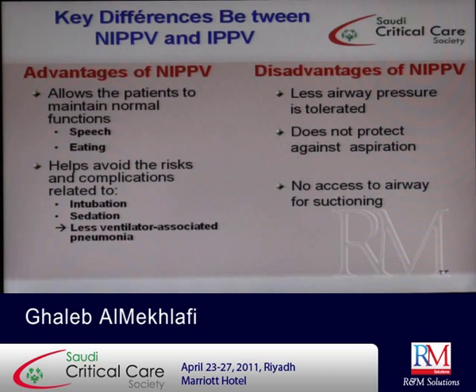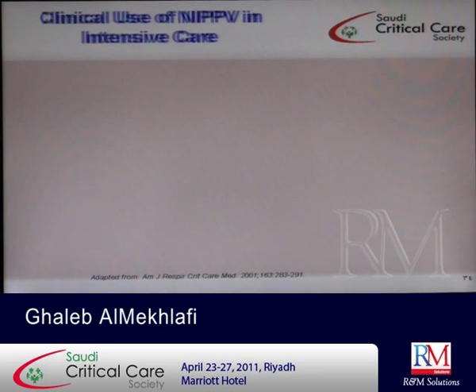The advantage is that it allows the patient to maintain normal function, speech and eating, helps avoid the risks and complications related to intubation and sedation, and causes less ventilator-associated pneumonia. But it has disadvantages: less airway pressure is tolerated, you cannot exceed 20 or 25, it does not protect against aspiration, and there is no access to airway suctioning. So it is not suitable in all patients.